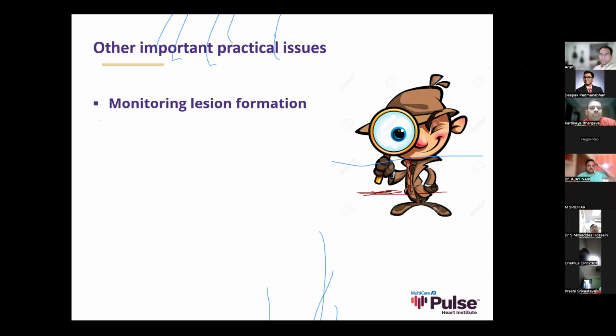And this impedance is not measured at one level, it is the system impedance of the entire circuit. It will have the impedance at the catheter tip tissue interface, at your grounding patch and skin interface, and all the other places where there is an interface, like the blood pool versus the catheter tip interface. All of those are combined together in what is called the system impedance of the catheter ablation system.